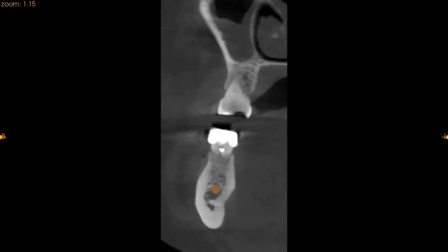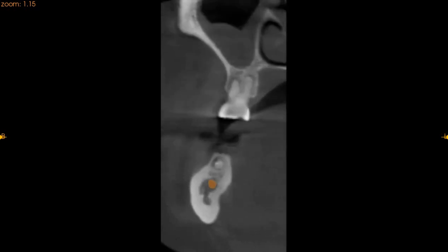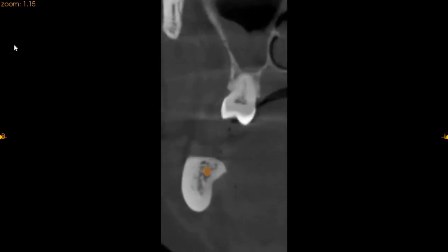On the lower left segment, the first molar is root canal treated with a crown. We would suggest extraction of this tooth because the lower left molar distal root shows signs of radiolucency. We have 6 to 7 millimeters of ridge width with approximately 8.7 millimeters of ridge height in that region.